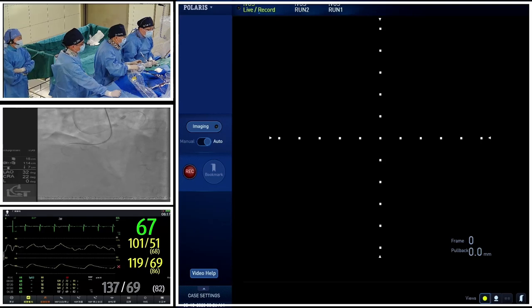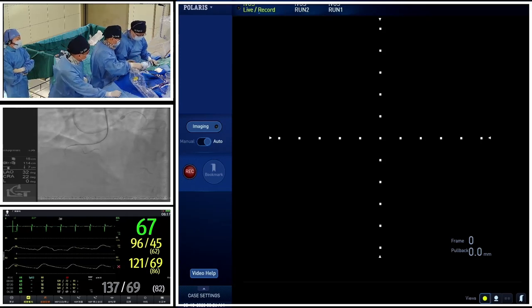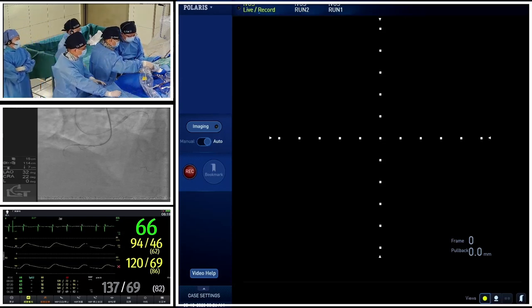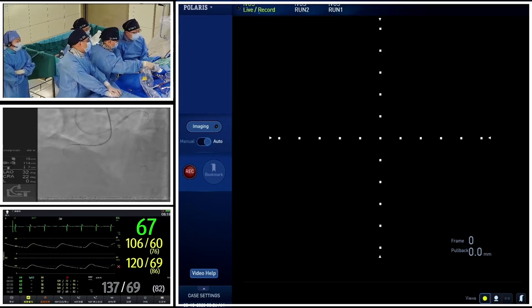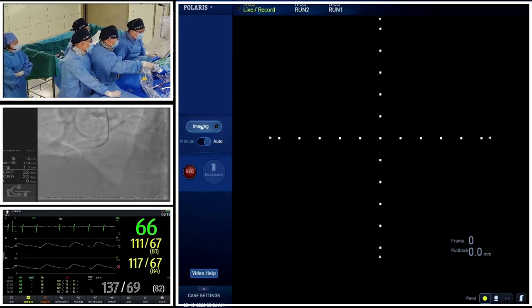And now we can see that whenever we are using the intravascular imaging with the microcatheter within the antegrade guiding catheter, here is some problem I'm going through. We're using a 7 French guiding catheter, and with a Caravel microcatheter. Oh, this is Corsair. Okay.